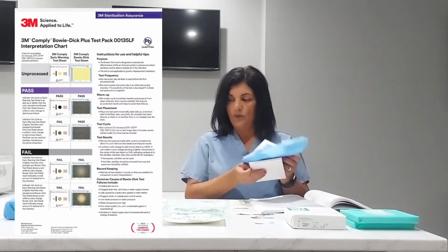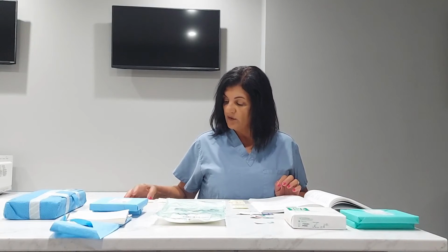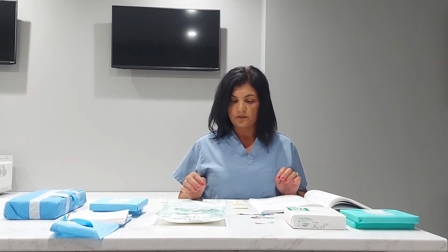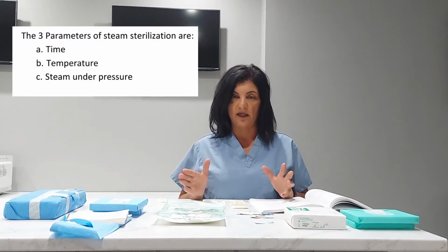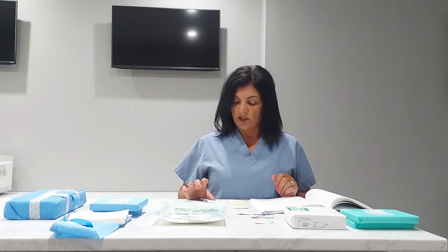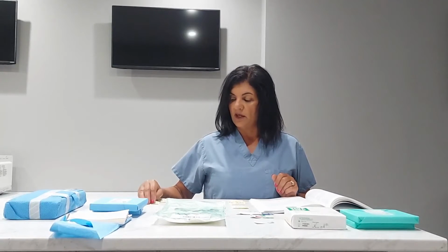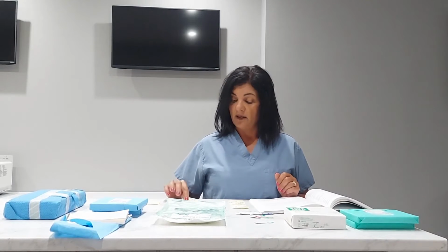Moving to your class 3, I don't have an example of a class 3. A class 3 is a chemical indicator that's designed to react to one of the 3 parameters. The 3 parameters again: time, temperature, steam under pressure. I will look up a copy of a class 3 and post a picture of it so that you know what they look like.